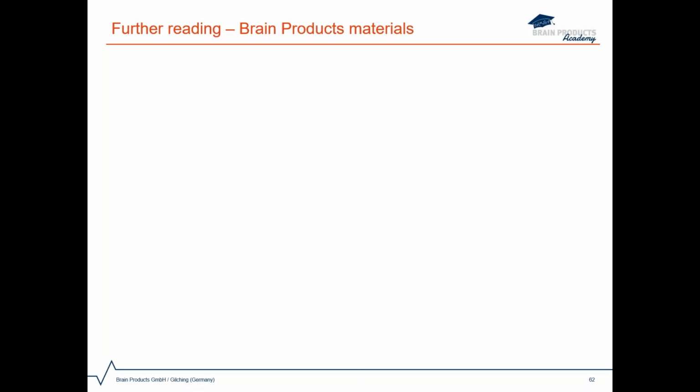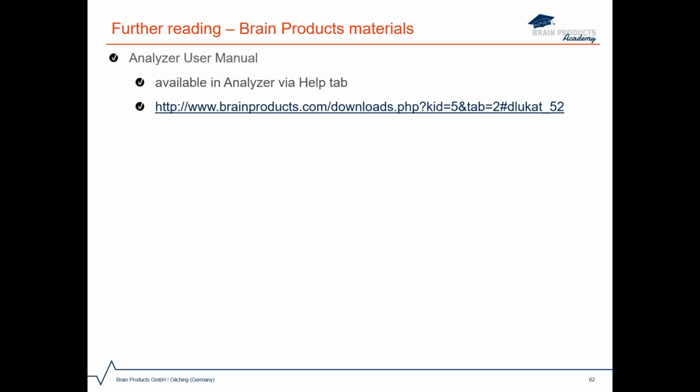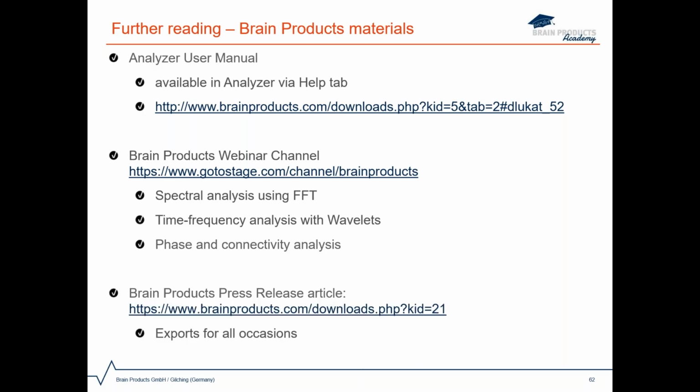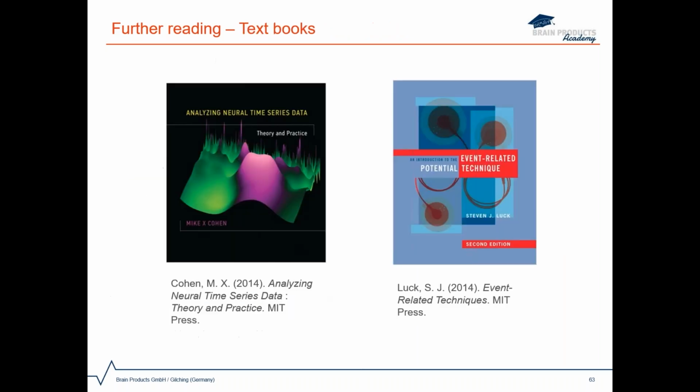Additional materials from our site. First is our user manual, where you will find very useful theoretical concepts as well as detailed information on the mentioned spectral analysis modules in their dedicated chapters. Second is our webinar channel, where you can access the video of the FFT, wavelets, and connectivity webinars. And for more information about export options, check out this very useful press release article, which will give you a quick grasp of the different export options that Analyzer offers.